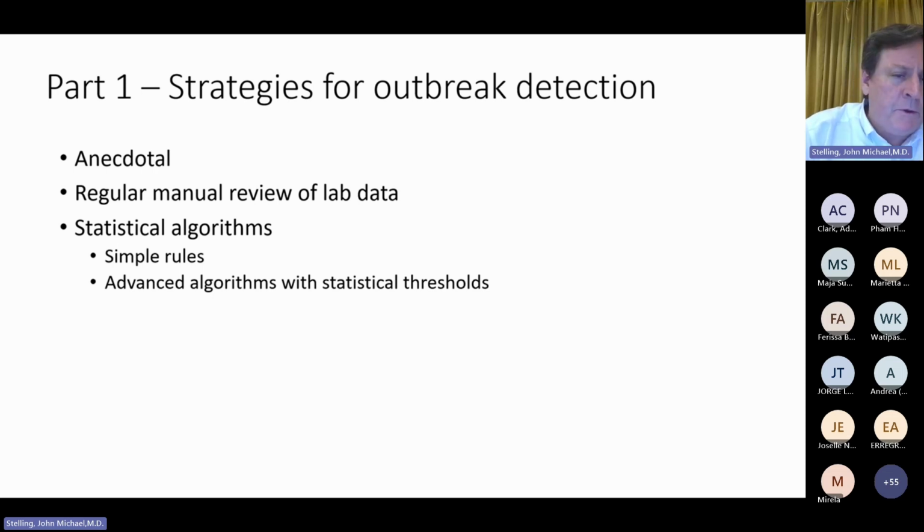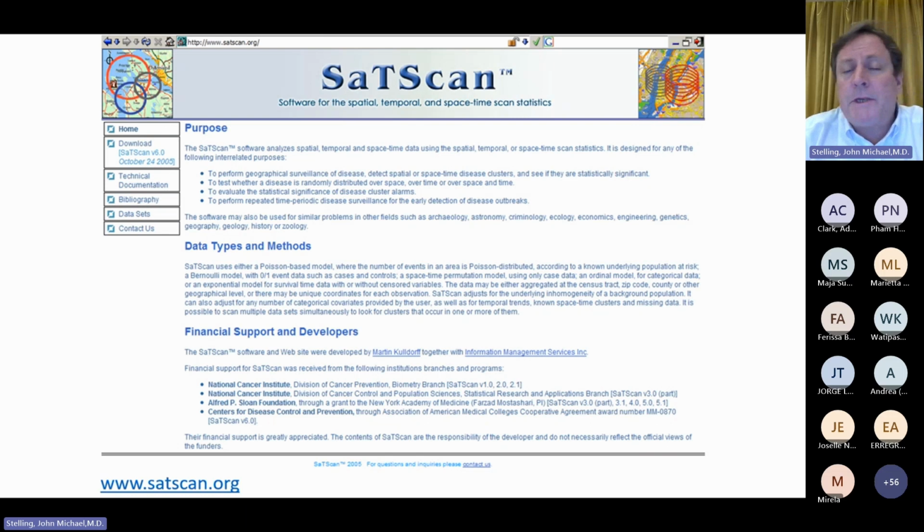There are very simple rules that indeed are too simple, such as 3 MRSA in 1 unit in a 2-week period to trigger cluster mode. Those are very simple rules. But today we will focus on more advanced algorithms. And we especially utilize the SaTScan software, which we introduced during the first webinar.